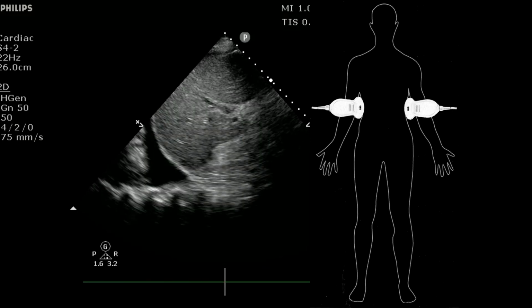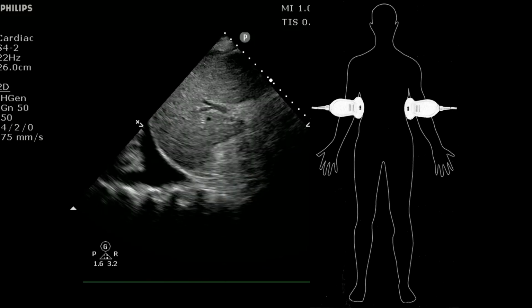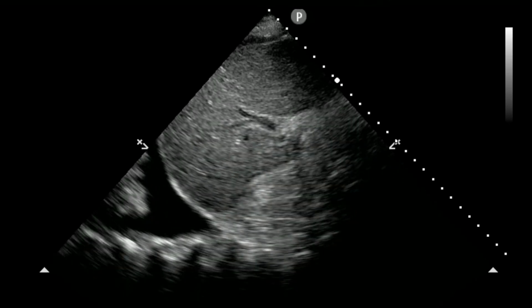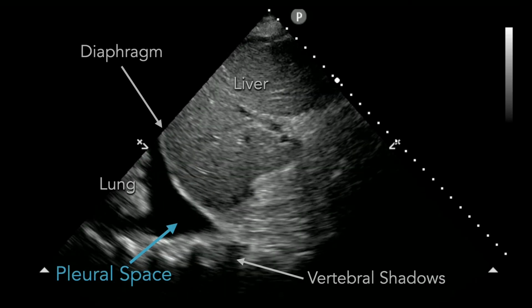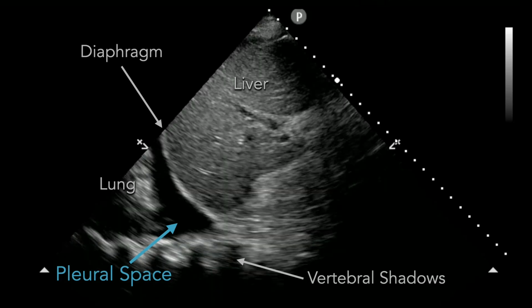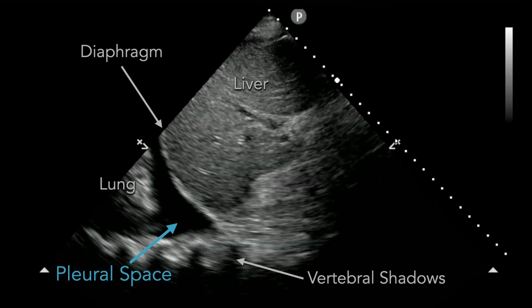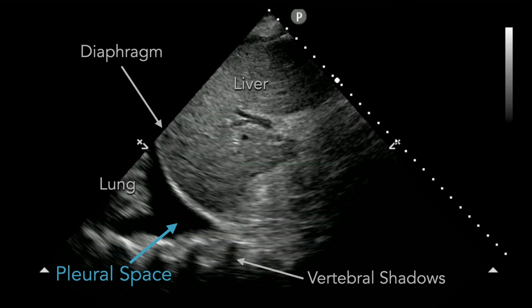There are a few things I've learned over the years that I have to be really, really mindful of, and those are identifying specific anatomic structures. I'll go to this image to make it a little bit bigger, and we'll put some labels on it to see what I'm looking for. Number one, the hard one to miss, and we're going to talk about the right upper quadrant. The same things apply to the left upper quadrant, just insert spleen here instead of liver. I'm looking for the major organ, that liver or that spleen.